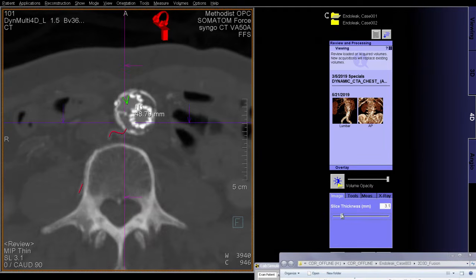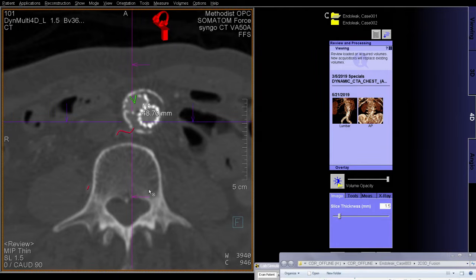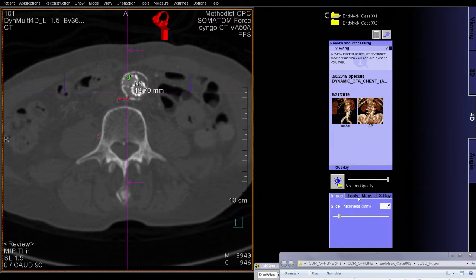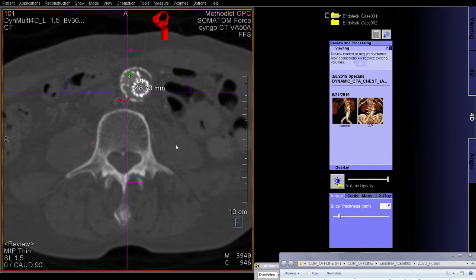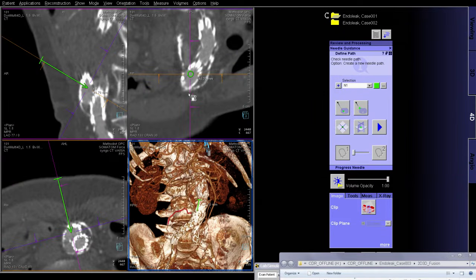So we're going to go anterior. Yes, this would be difficult to do translumbar because there's not a lot of space. When you come translumbar, you've got to get a needle in the aneurysm sac without sticking the stent graft. You've got to get a wire in the aneurysm sac. You've got to get a sheath, and the sheath has to project into the aneurysm sac, otherwise it falls out. And then you've got to get a diagnostic catheter, which can be very difficult to manipulate inside the aneurysm sac. So again, it's always a matter of, preferably not through the stent graft, trying to choose the appropriate path to give you access to these target vessels.